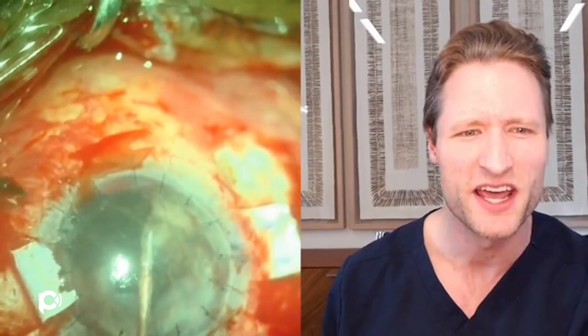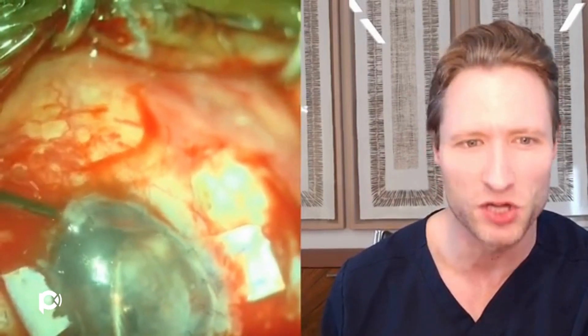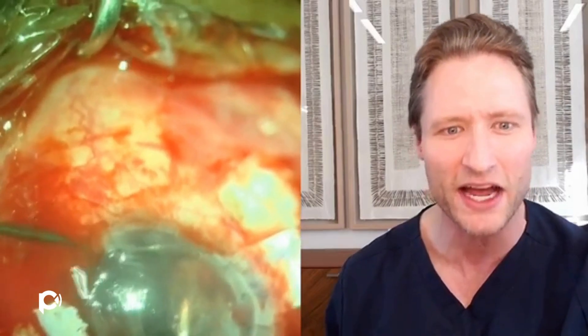You'll notice that the red reflex is poor — basically non-existent — because this eye is bleeding. Even so, considering the proximity to the ciliary body and the fact that I'm munching iris in a patient who's chronically anticoagulated, there's actually not as much blood as you would think. That's because this tissue is necrotic. It's not normal. You can't leave this in the eye or it will inevitably sock back up against the back of the patient's cornea. So it's got to go.